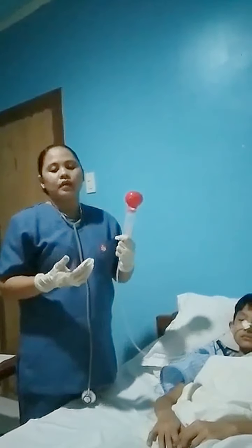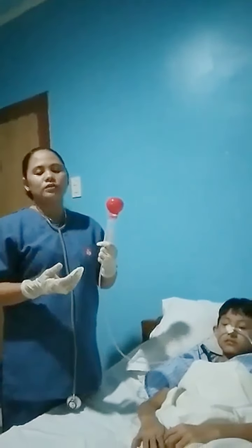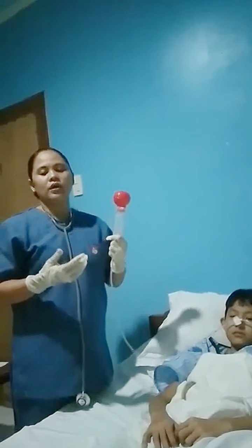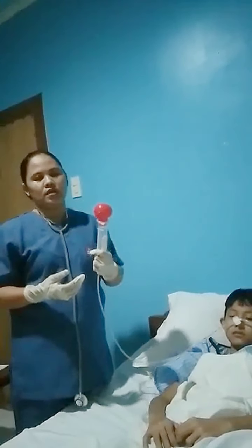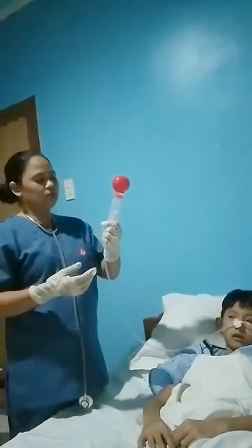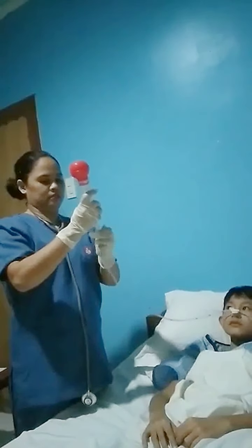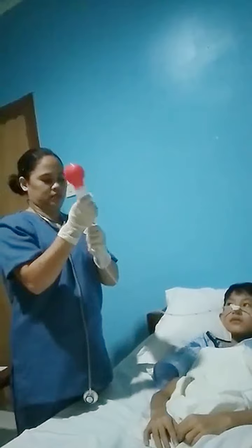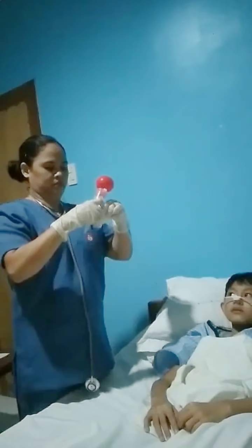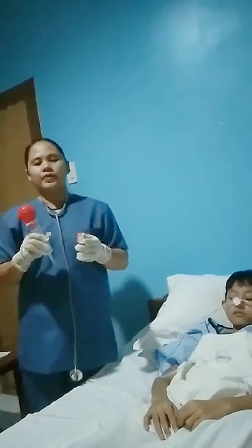Now, we will know if it's in the stomach because the pH level of the stomach should be 1 to 5, and beyond that, it would mean that it is not the right direction or it is not the right location. Remove the aseptic syringe and make sure to kink and close it back. And test the pH level for the aspirated content.